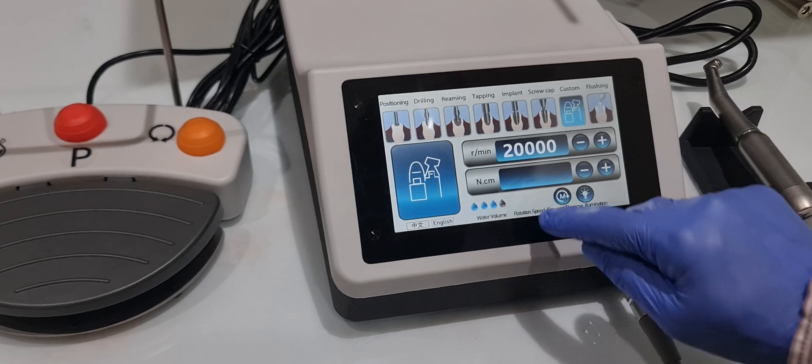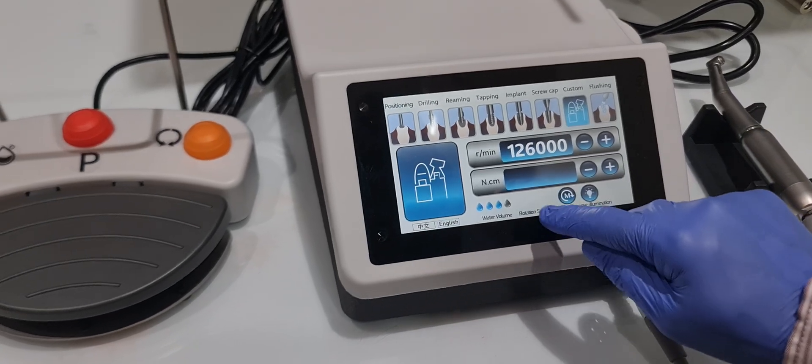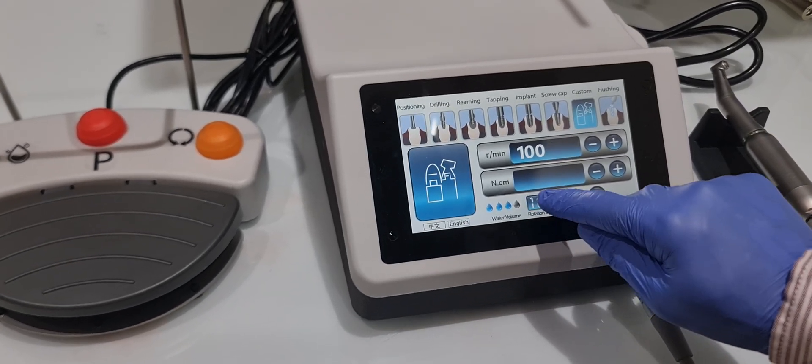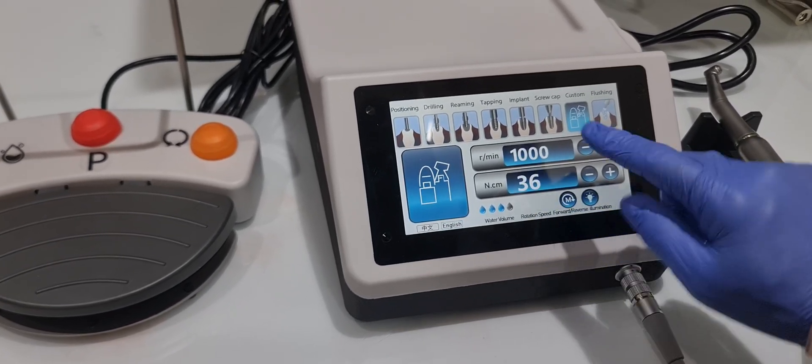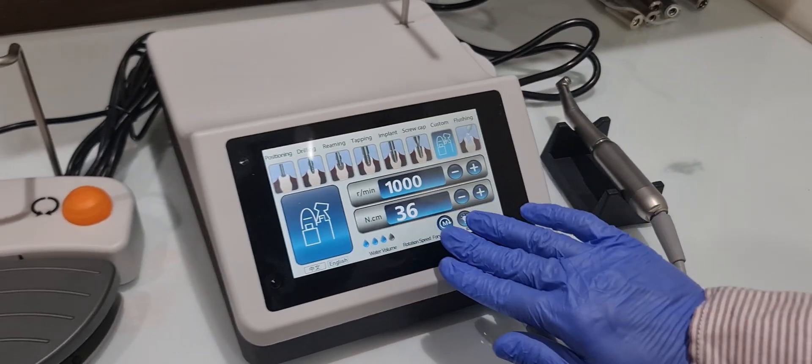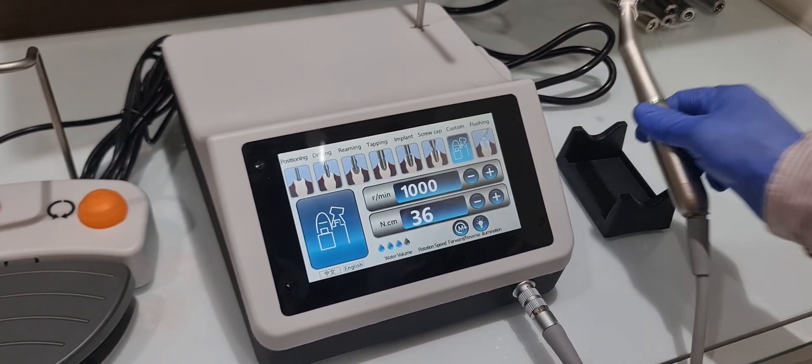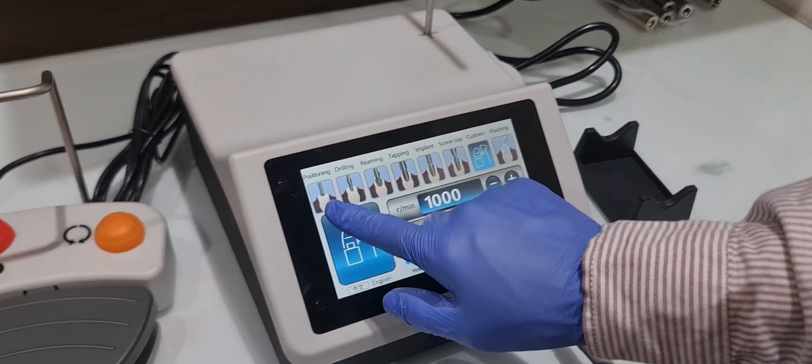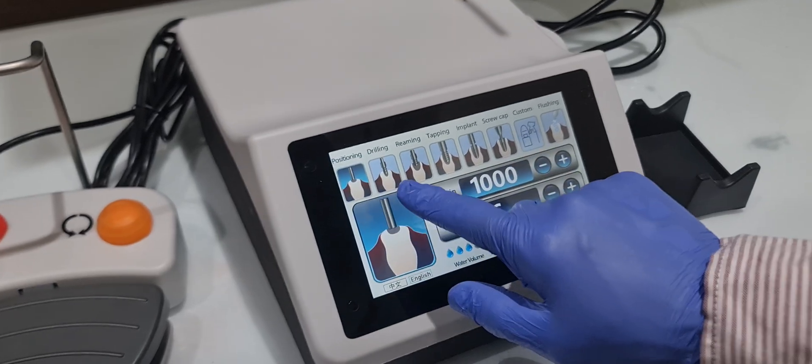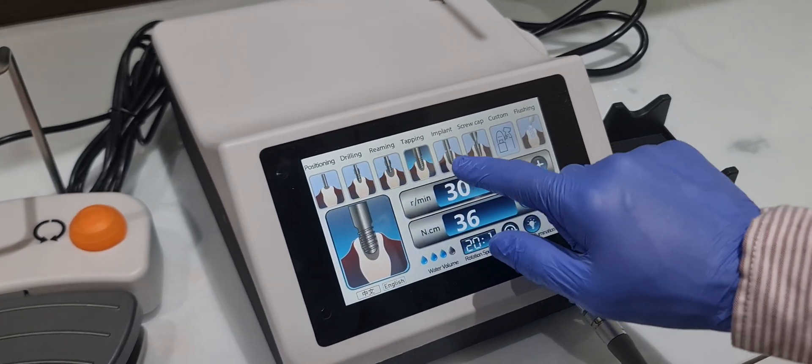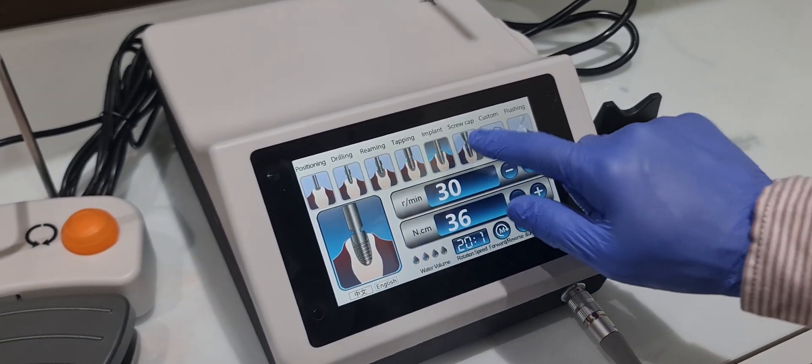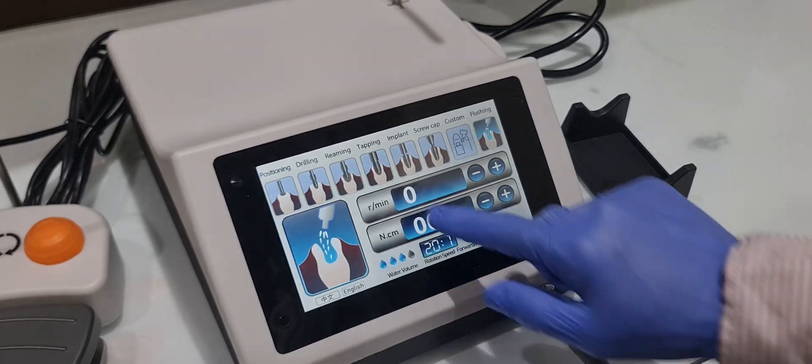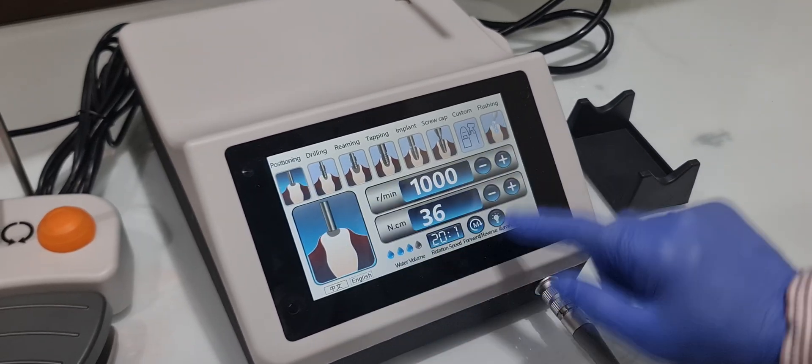If you want to use 20:1, this is for implant procedures. Here you can see positioning, drilling, rimming, tapping, implant, screw cap, and flushing.